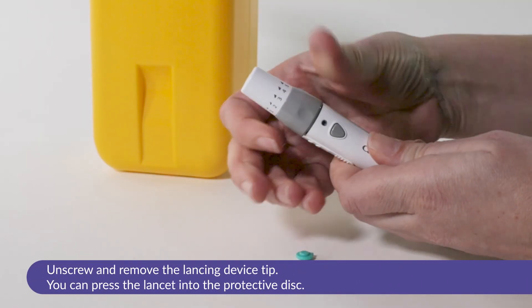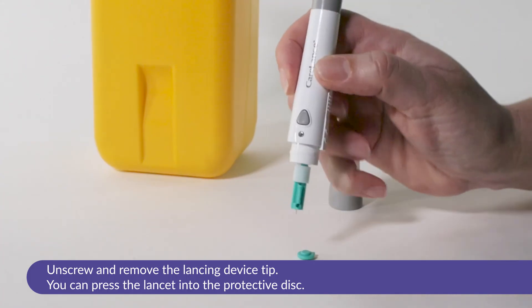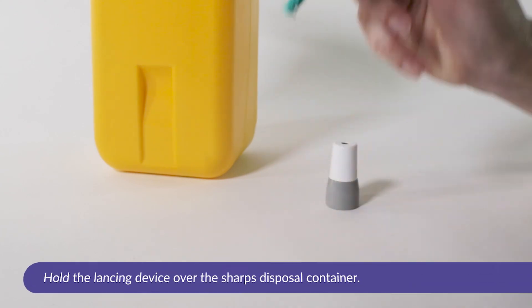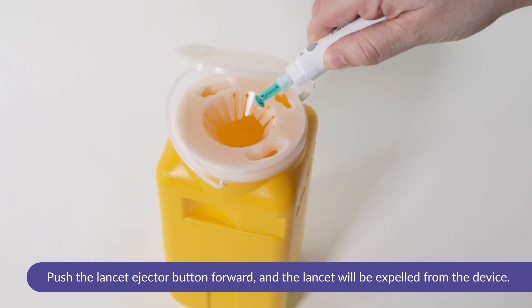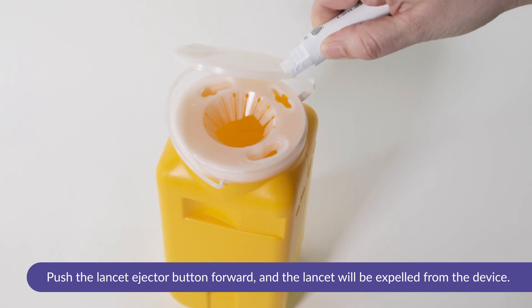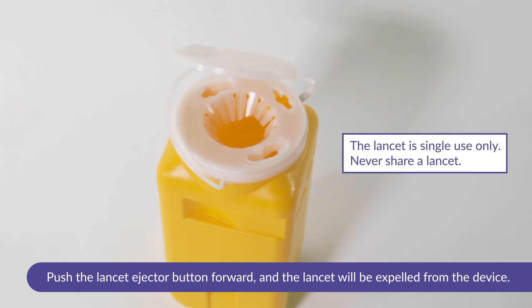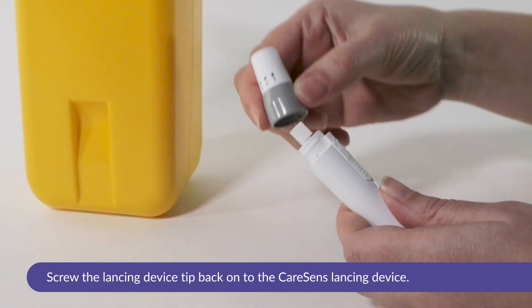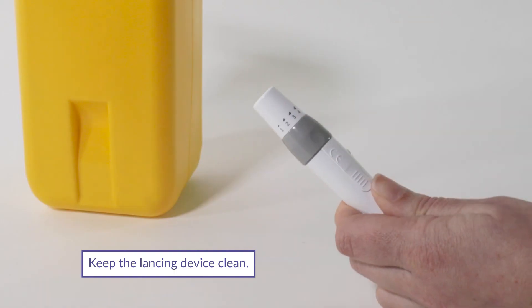After completing the test, unscrew and remove the lancing device tip. If you wish, you can press the lancet into the protective disc. Hold the lancing device over the sharps disposal container. Push the lancet ejector button forward and the lancet will be expelled from the device. The lancet is for single use only — never share a lancet. Screw the lancing device tip back onto the CareSense lancing device and keep the lancing device clean.